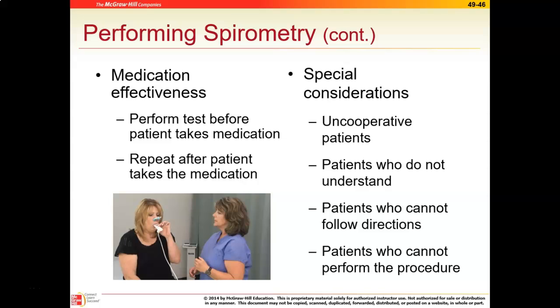And so you can kind of hear the machine. It makes a high-pitched sound, and as it's getting closer, it'll have a beep. And so coaching them to that point, saying, keep going, keep going, keep going, is really important because they need to hear that voice so they know not to stop. Because if you just sit there quietly, they might just give one exhale quickly, and you'll have to coach them through. So that's why we need to be real vocal and communicate well so they understand what's going on and what they need to do.